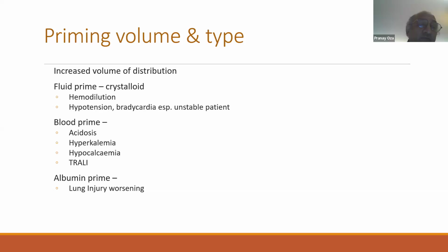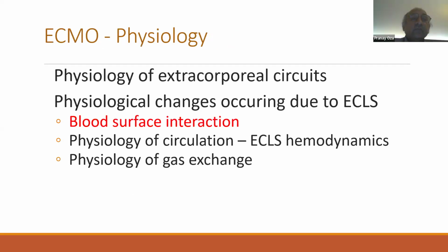And when you are using albumin for the prime, it will increase the risk of lung injury. So again, the lung injury can further worsen. So that's about the ECMO physiology related to the circuits.